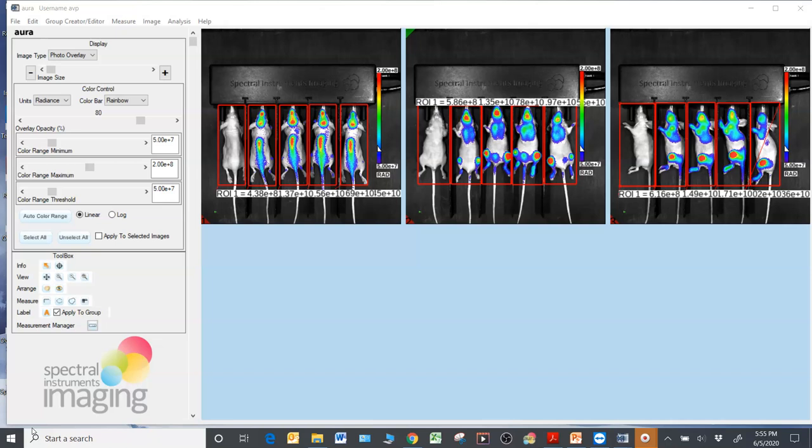Now, in this example set of files that I've pulled up, I've done total mouse ROIs on the 5 mice in each of these 3 images. This is an example of the use of a near-infrared probe called OsseoSense 750, which binds to the growth plate in long bones of the mouse. And you can see some interesting differences in the distribution of the signal based on the orientation of the mouse, either dorsally, ventrally, or positioned in profile.